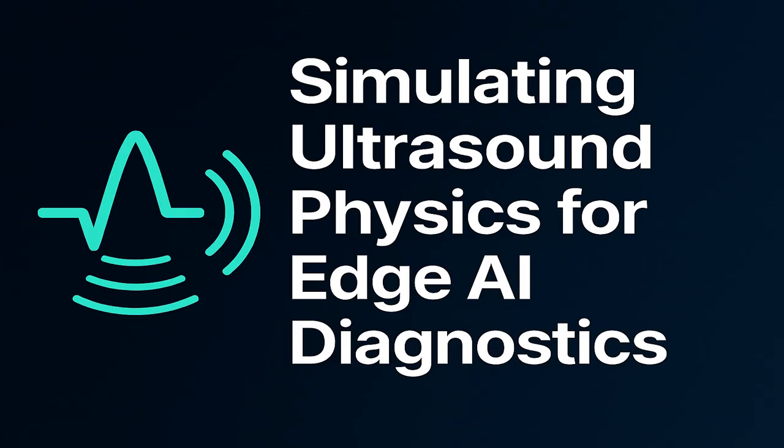Just think about that for a second. The element of physics that is responsible for your spatial resolution is shorter than one third of a millimeter. And that tiny wavelength is why ultrasound can offer such impressive axial resolution, the resolution in depth. It is. If you were trying to find a sub-centimeter lesion, that 0.3 millimeter resolution is the difference between seeing it clearly and, well, just missing it entirely.